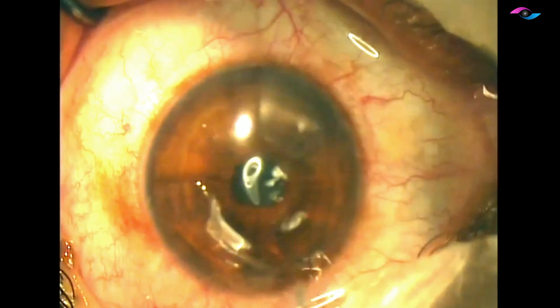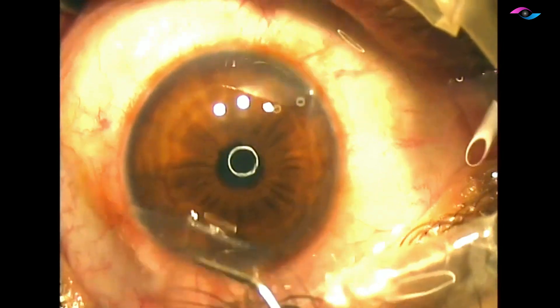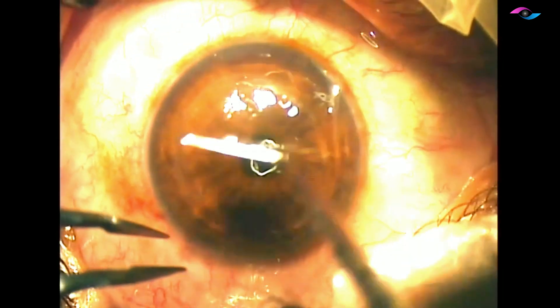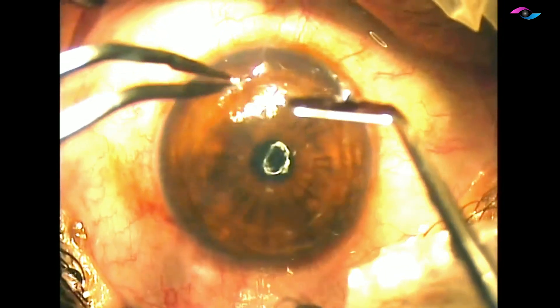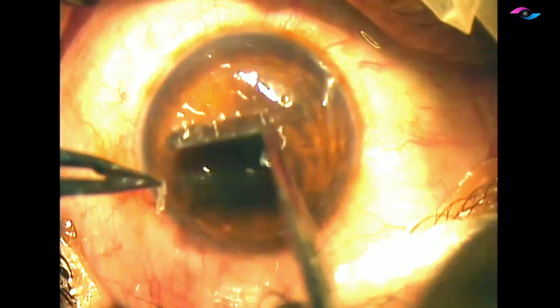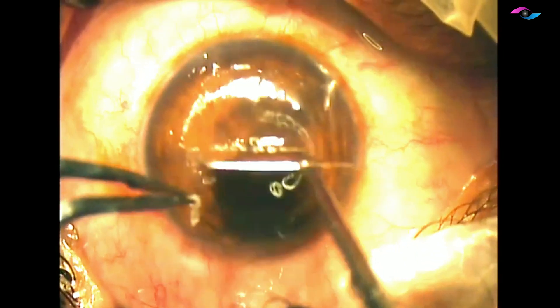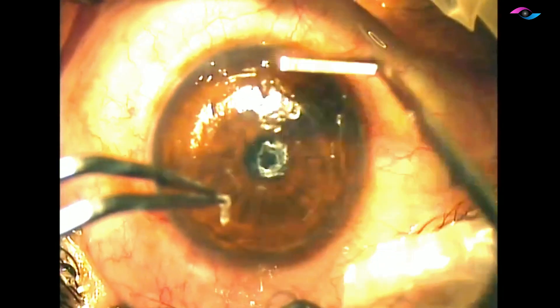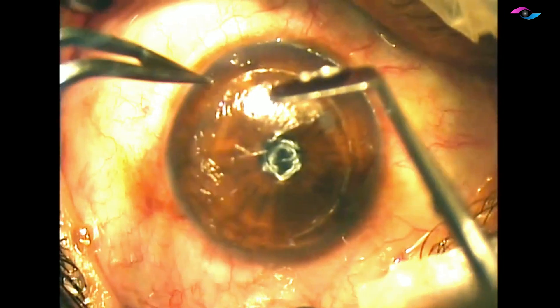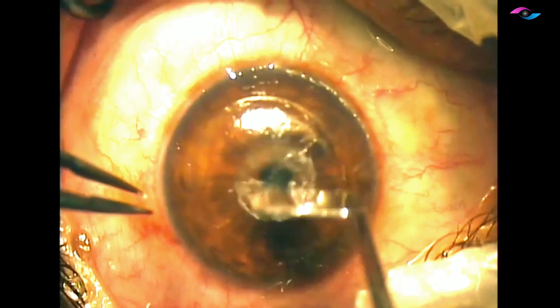Once we have done that, we place the flap back in position. I'm also removing the epithelium on top of the flap to prevent recurrences — especially in the area where the flap was cut and also from the area where the cells got seeded, which is inferiorly for this patient. I'm sitting superiorly, so inferiorly is where the epithelial ingrowth was, and I'm making sure we remove the epithelium from the top of the flap and surrounding cornea.